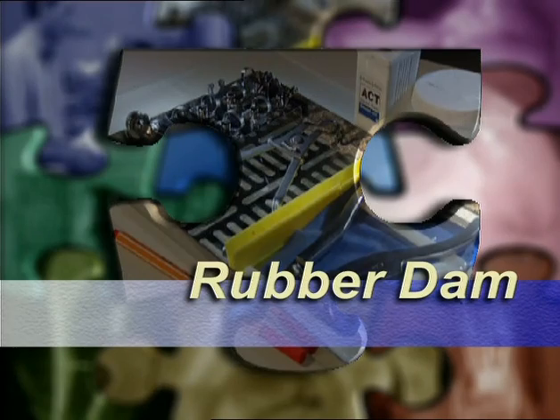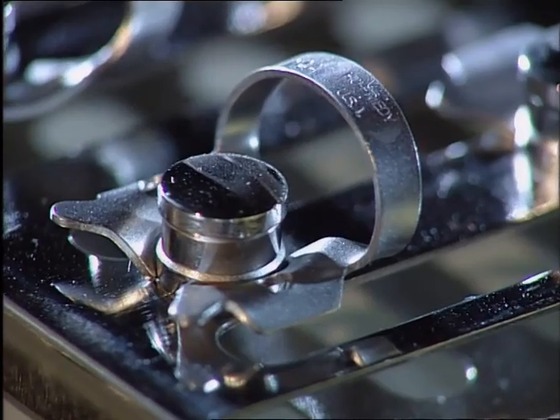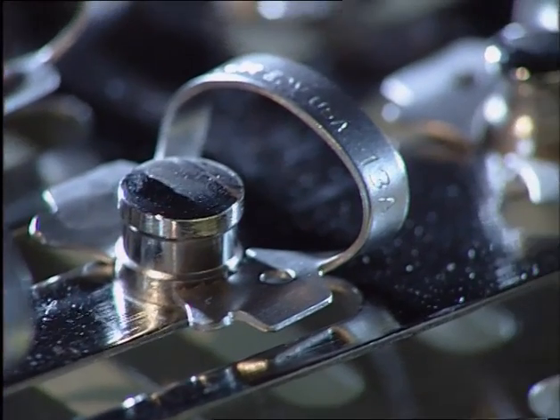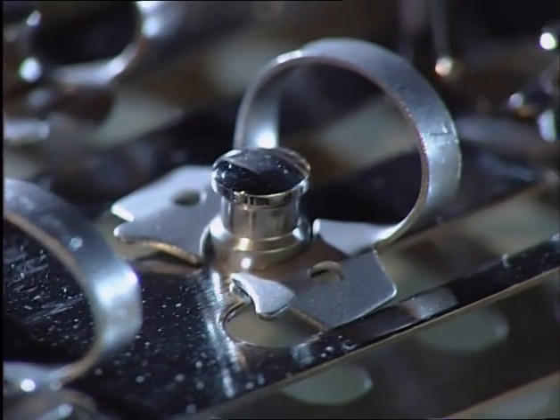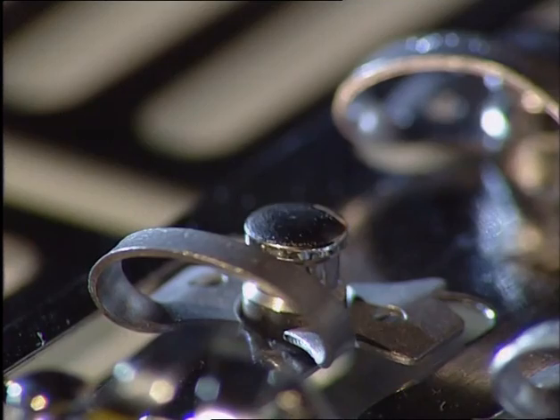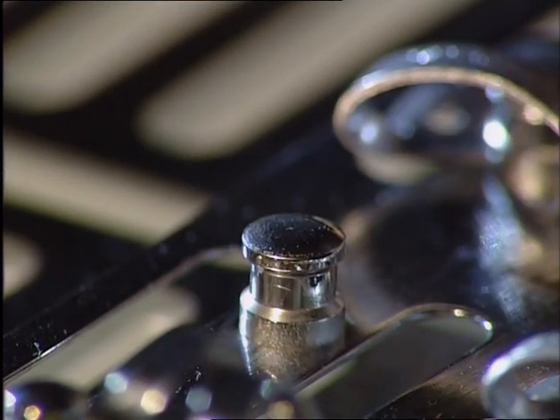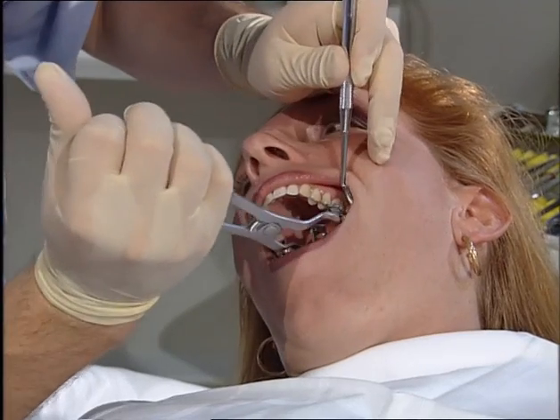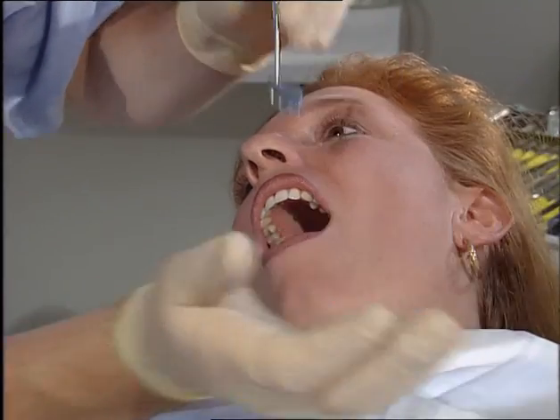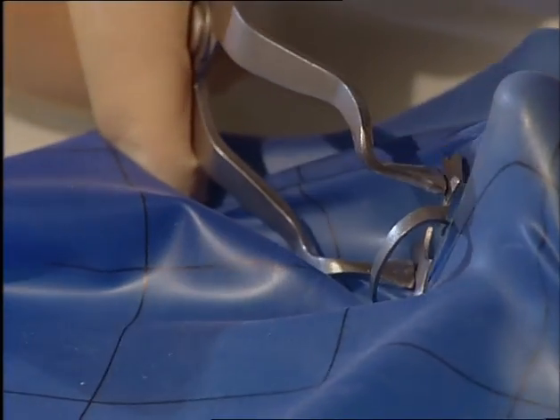Rubber dam isolation is the standard of care in endodontics. In endodontics, we just need a basic set of rubber dam clamps. The rationale for the use of rubber dam is patient protection from aspiration or the swallowing of instruments, medicaments, or irrigating solutions. It provides a surgically clean operating field, isolated from saliva, hemorrhage, and other tissue fluids. The rubber dam clamp should demonstrate a firm fit without traumatizing the gums.